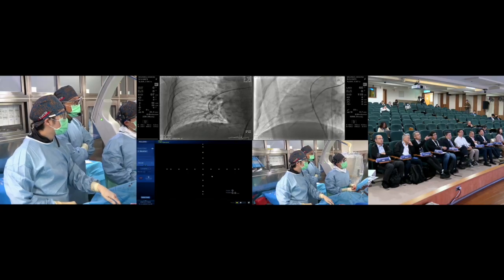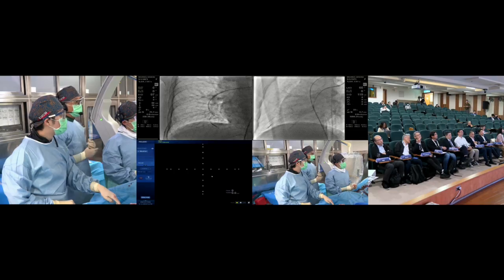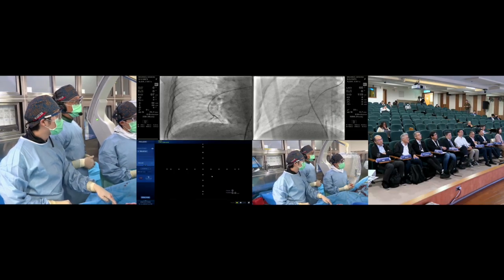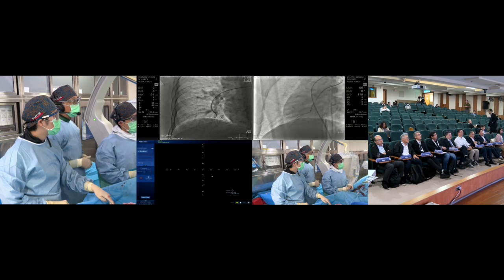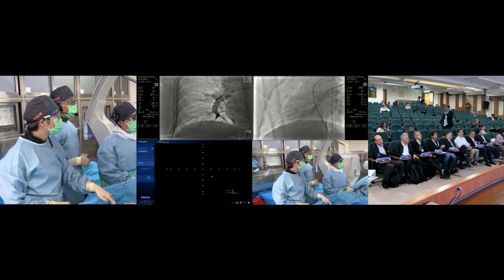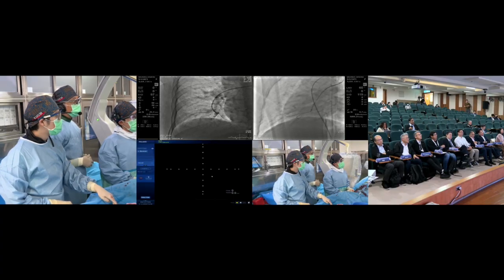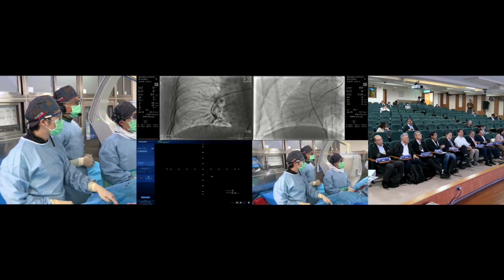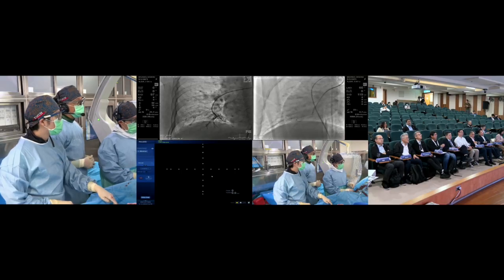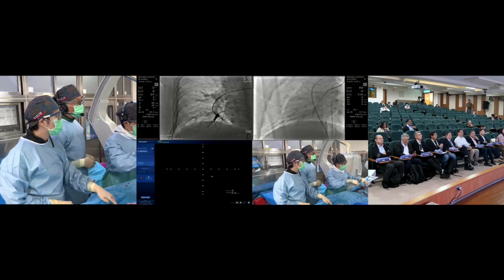And this is after. So we can clearly see the venous return getting better after the procedure. So I think maybe we just leave it for now for this zone of lesions.